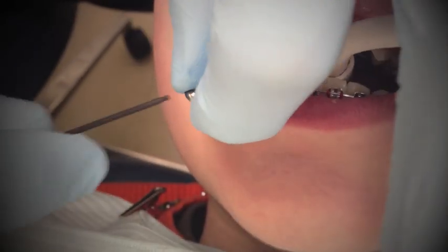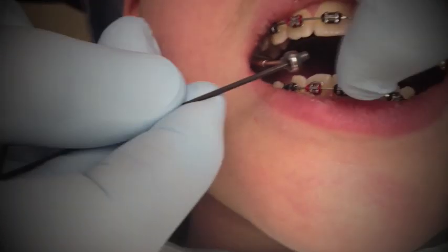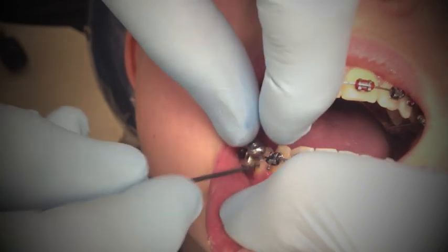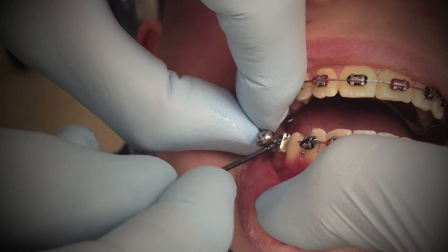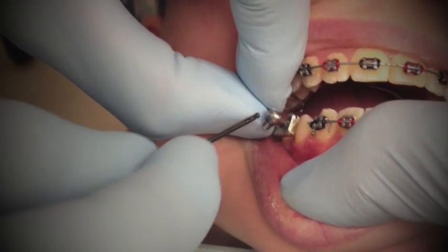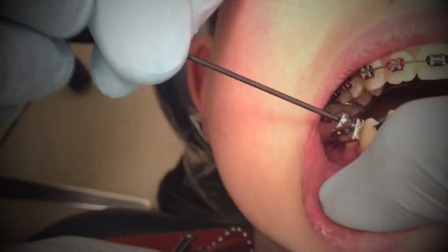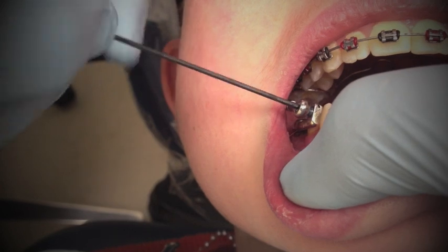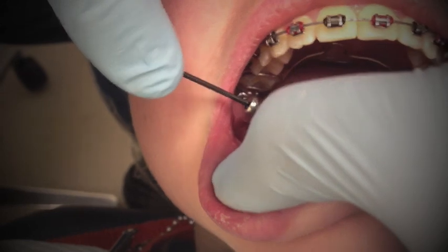I put my finger here because this stuff comes out really, really fast — just put a drop on the threads. Then I need you to open and slide your lower jaw forward. Slide forward — you're going to come way forward. The biggest thing when you put this in is you don't want to strip the threads; you've got to make sure the threads are going in straight.